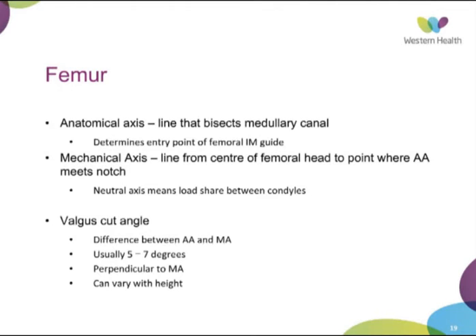And usually this is quoted between 5 and 7 degrees, but it can alter depending on the height of the patient. Taller patients will have a lower angle between their anatomical and mechanical axis and a lower valgus angle. And our cut angle is perpendicular to the mechanical axis.